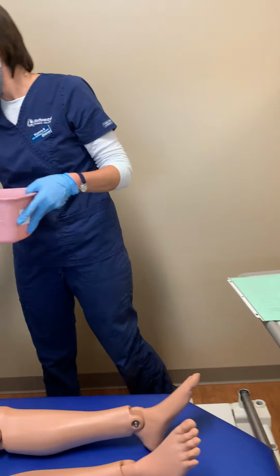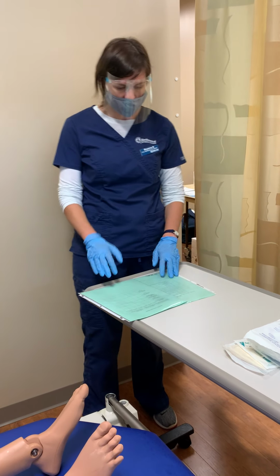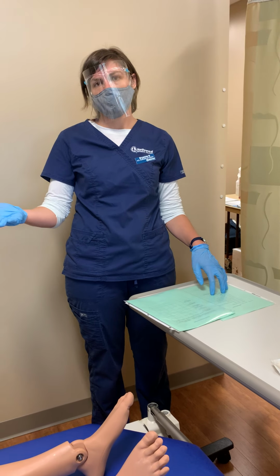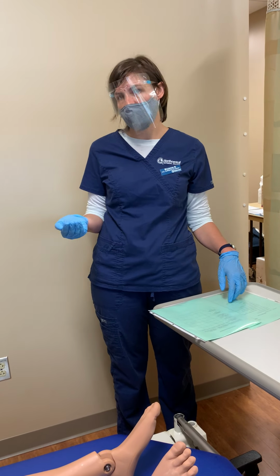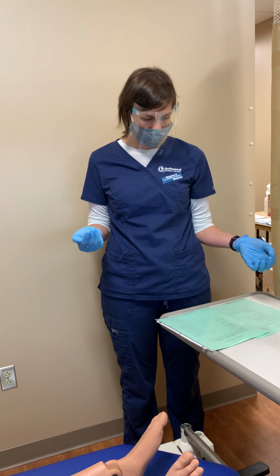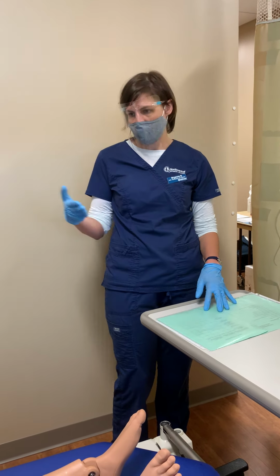Now for the last skill, we're going to do our central line dressing change. This is usually something that the facility has ordered to do so many days, or where I work, they do it every Monday, or as needed, which is what's listed in this order. So if the dressing were to become soiled or peel back too much to be trustworthy to be holding the pick in place, it would need changing. So I'm going to get it changed for Francis now that I've finished administering those necessary medications.